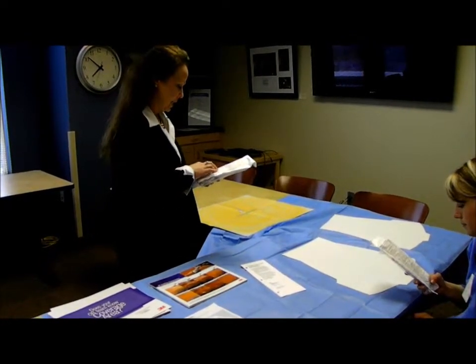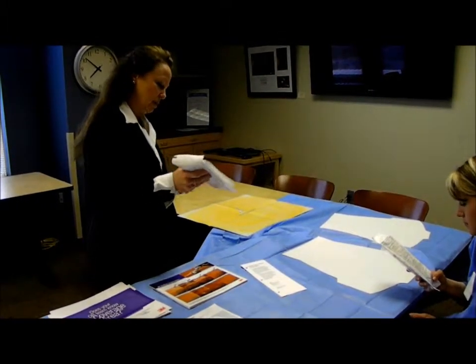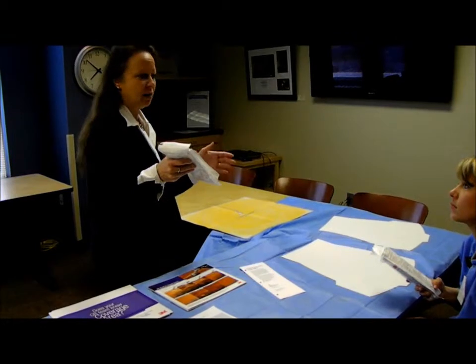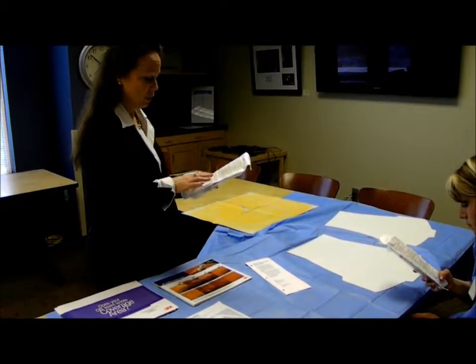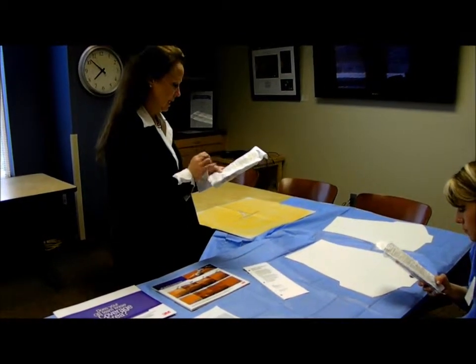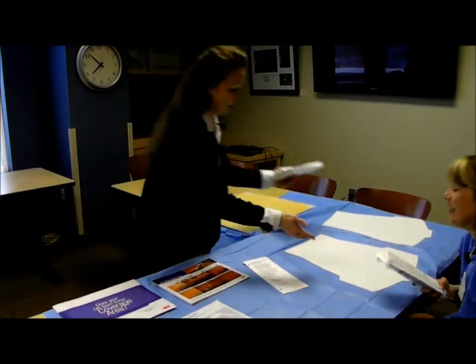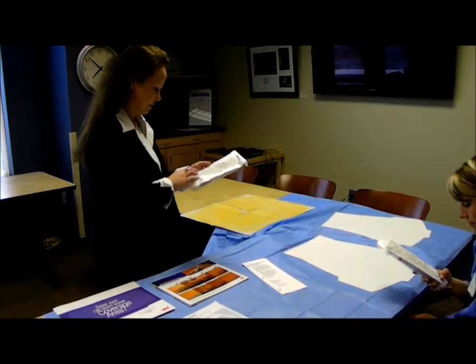You want to make sure that when you activate the applicator that you hold it parallel to the ground, to the floor, so that you get an even distribution of product on the sponge. That will prevent any leaking and pooling of product. When you apply it, again, you want to paint it, do not scrub it, apply uniformly. You don't have to go back and forth at all. Sometimes on some occasions, if someone's really skinny or you're a sloppy prepper, you might want to put towels on the sides of the patient to avoid pooling of the product, okay?